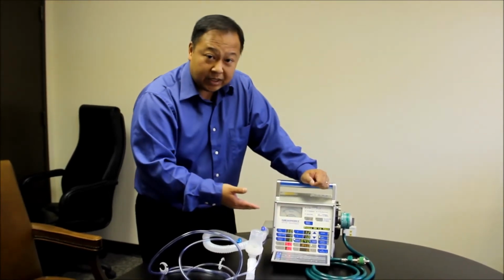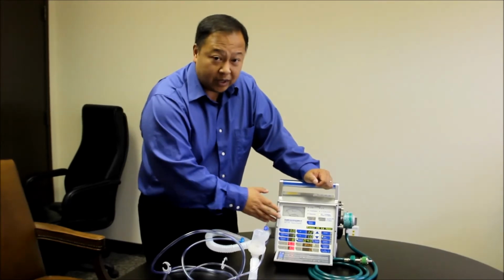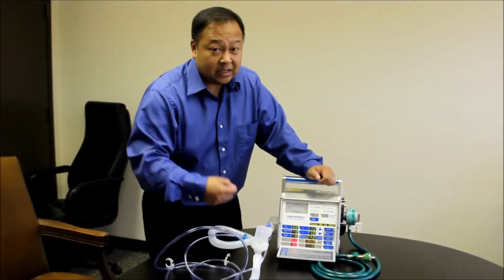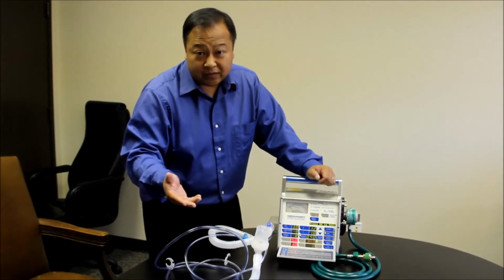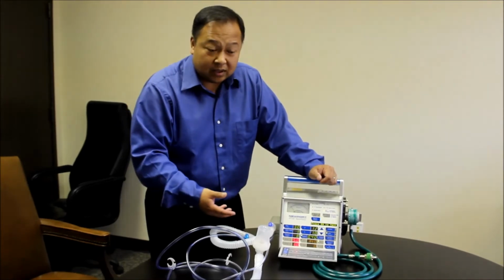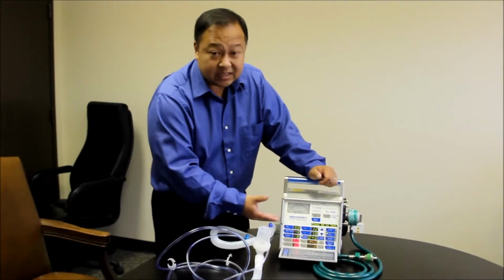But let's say, for instance, the patient wants to breathe 16 breaths a minute. Remember, on AC mode, every single breath that the patient triggers, he'll get the full amount. On SIMV mode, those 4 extra breaths that the patient takes are the patient's own breaths. So the patient could be breathing a tidal volume of 200 if he wanted to, or if they wanted to take a deep breath, a sigh breath, they can breathe up to 600 or 700 mLs per breath with the SIMV mode. Okay, so that's the difference.